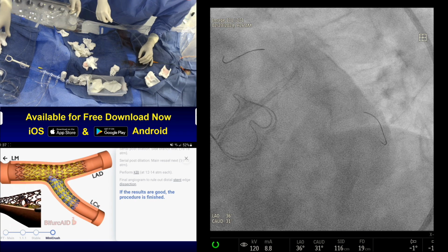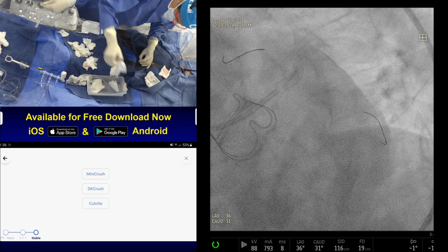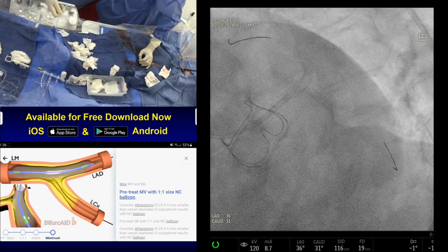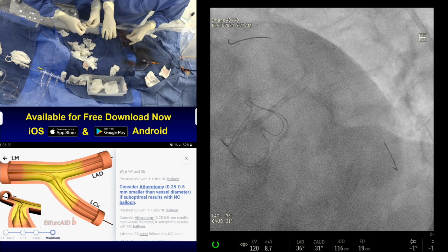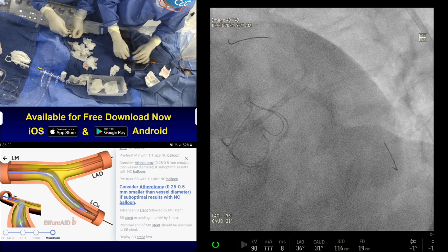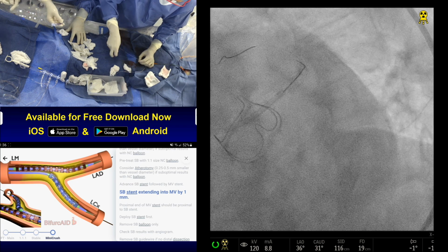The question always comes. So it's not uncommon that despite you do a little POT and the wire was there, it did not go, so with angulation. Otherwise, non-compliant will go. No, the thick strut. Yeah. But thick strut, we may for this always have angulation issue. Dr. Samin, this is tough. Yeah, exactly. And then the Megatron, but the gap is still the same. Even if the gap is there, the thick strut is not allowing us to make that turn. Okay. I mean, you have to be ready for anchor. Wire has come.